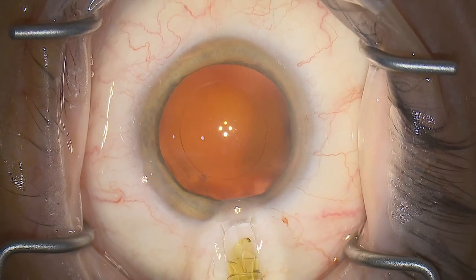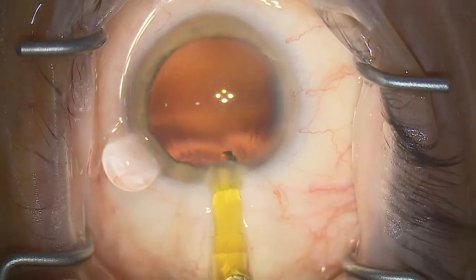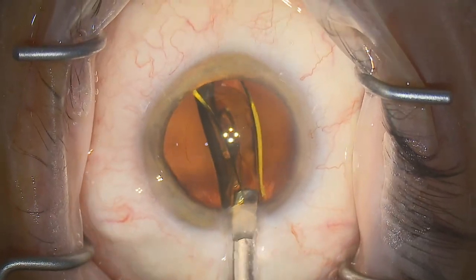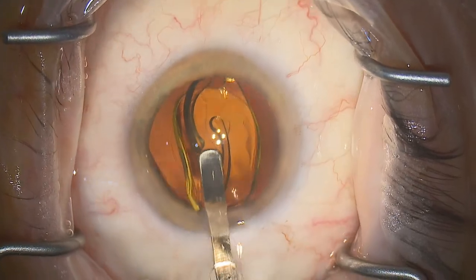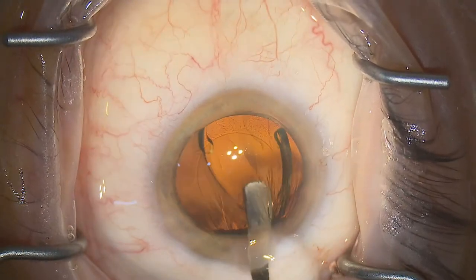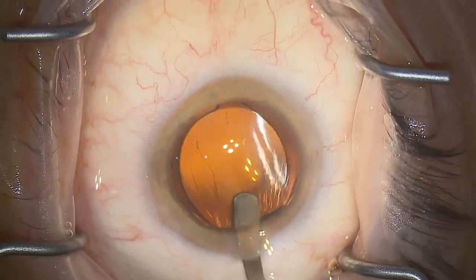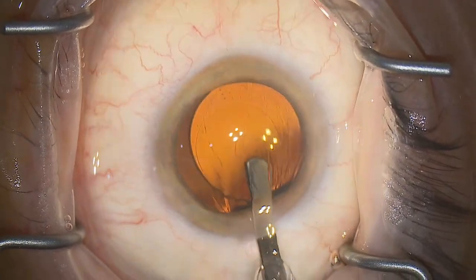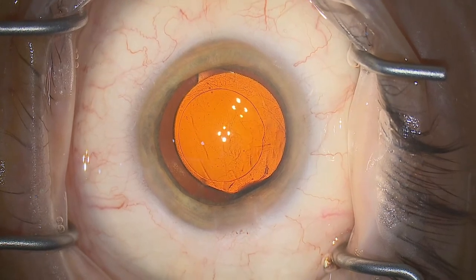In the live demonstration: tease up the anterior lip of the entry site with the cartridge, ask the patient to look towards you to maintain position, then look straight ahead as soon as the lens is unfolding. Advance the plunger fully and use it to manipulate the lens optic into the bag. Finish with rough positioning — this is a toric lens, left about 10 degrees anti-clockwise of the target blood vessel or mark.